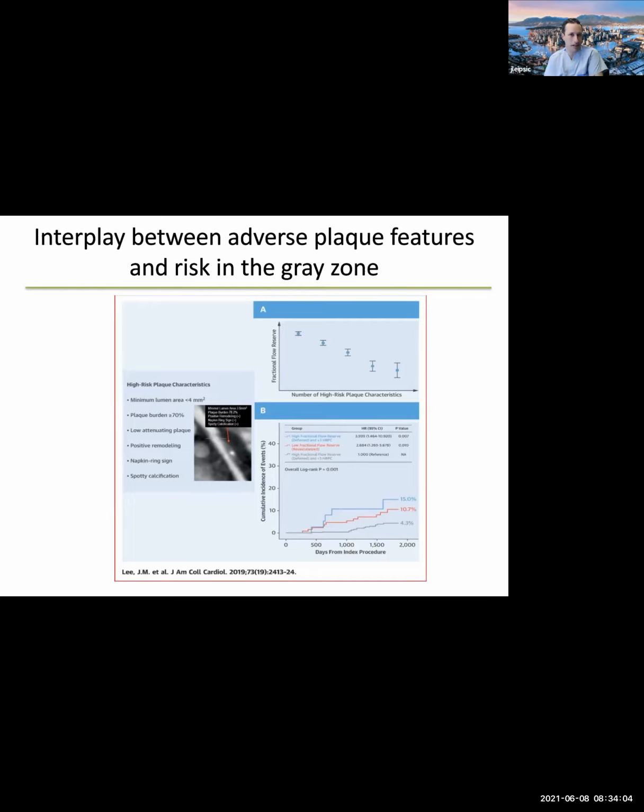In fact, there's good data that would suggest that if you have adverse plaque, you're more likely to have abnormal physiology. About 4 or 5 papers have explored that in the literature, plaque by CT. And there are many people who posit why that may be. Maybe poor local vascular health, inability to locally vasodilate and accommodate hyperemia. But beyond that, we've seen very interesting data.